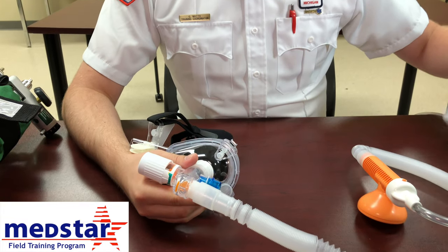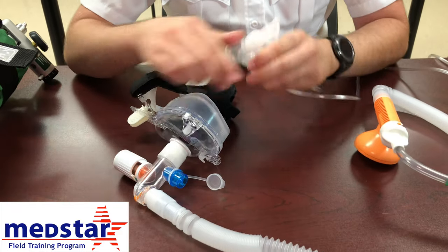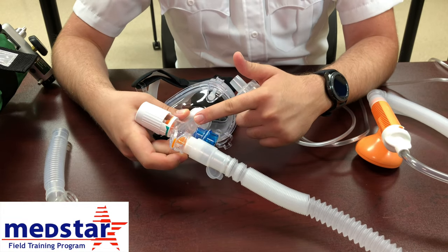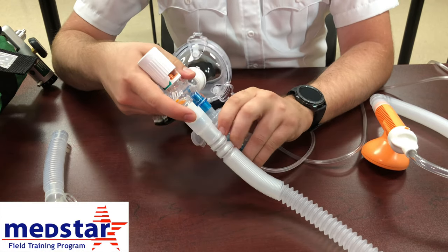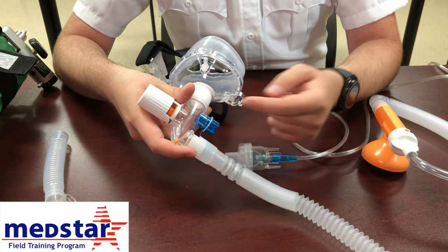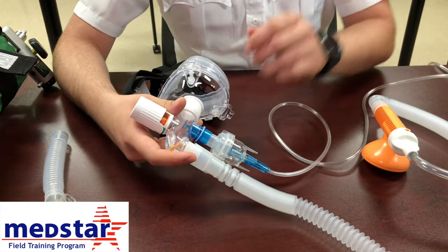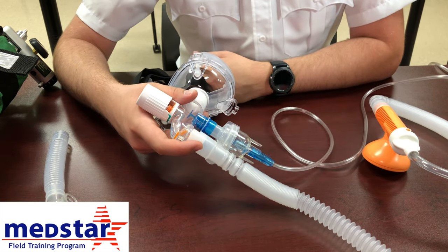You can also attach a nebulizer to the CPAP. Instead of assembling the full nebulizer piece, just take the T-part off the nebulizer. Down here, there's already an adapter in-line with the CPAP — you just plug it right in and it opens up that valve. This is a one-way valve, so when you remove the nebulizer, it closes automatically. You don't have to worry about capping the bottom. Just attach the nebulizer to oxygen, set it to the appropriate flow rate, and it will administer medication in-line with the CPAP.